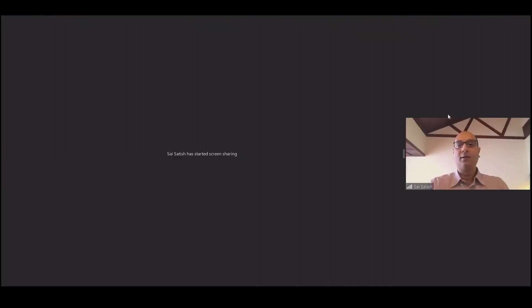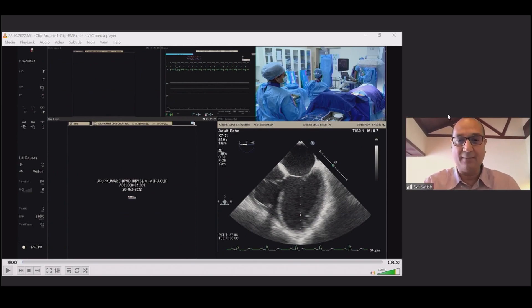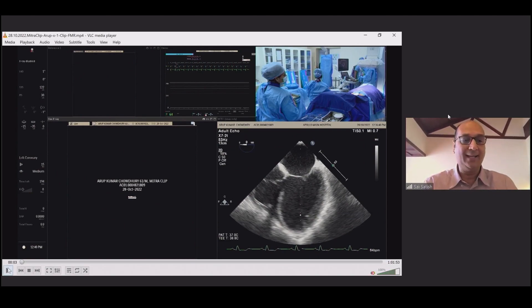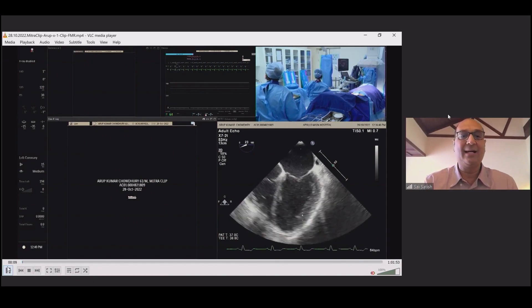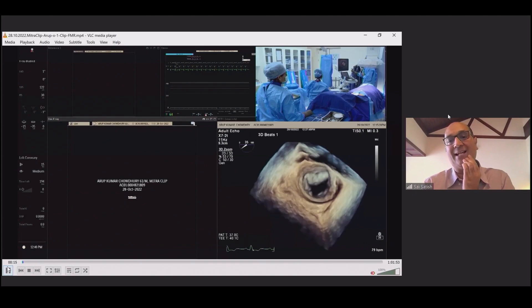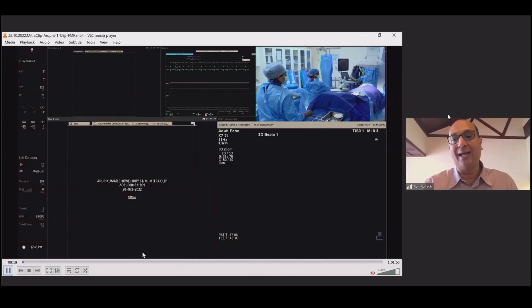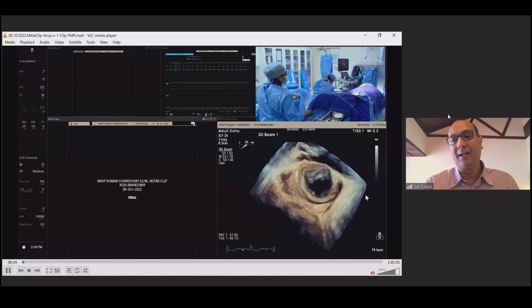I think we should see the case — that's what you're here for. So I've kept the unedited video recording. I must confess I'm not very good at live in-boxes while doing live cases, so please help me along the way. The patient is under GA. There's a pre-procedure TEE done about 10 days back — you can see there's enough length of the anterior and posterior leaflet. From the 3D enface view there may be a small cleft in the posterior leaflet, but the majority of the jet is central — functional A2P2, tandem slightly laterally.